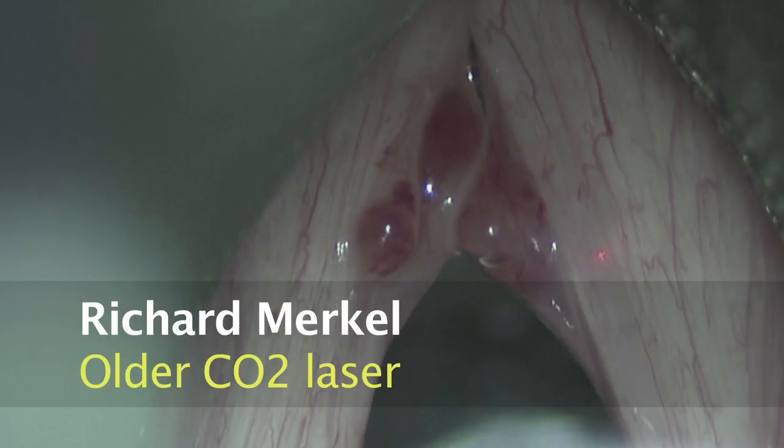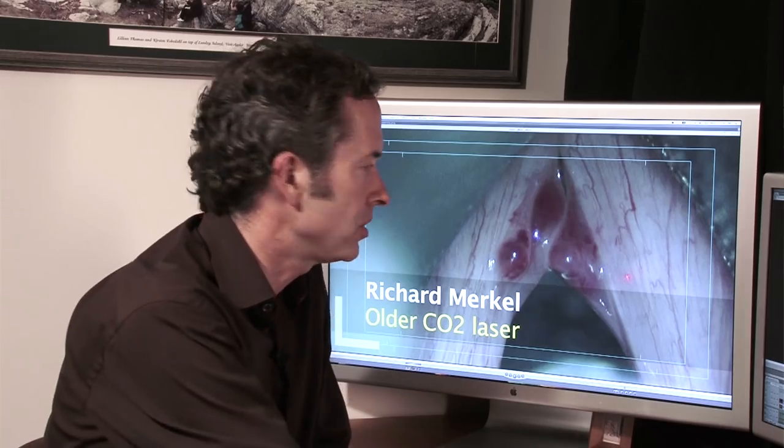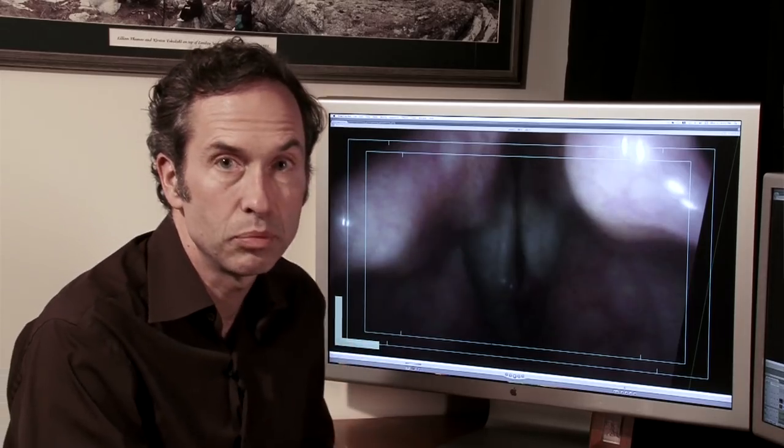Let's meet Richard. Richard has quite a few injuries to his vocal cords — we have a number of hemorrhagic polyps here. We'll take a listen to his voice. We'll see that he has air leak from in front and behind the polyps and that sometimes he has diplophonia.